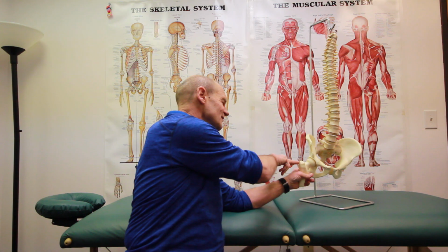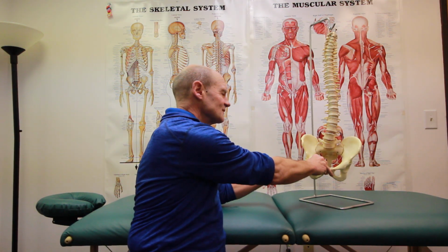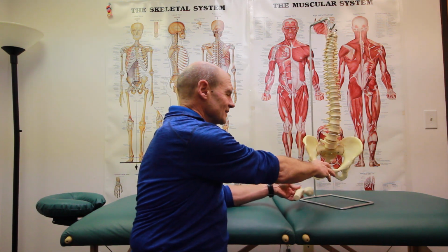If we could get that lift happening at the hip joint, the axis of rotation of the legs, you were going to get the most normal motion with the least amount of effect anyplace else in the body. The body wasn't going to be fighting it. And I spent the next 15 years going to trade shows, looking in trade magazines, trying out a few ideas myself of how to get that lift to work through the hip joint.